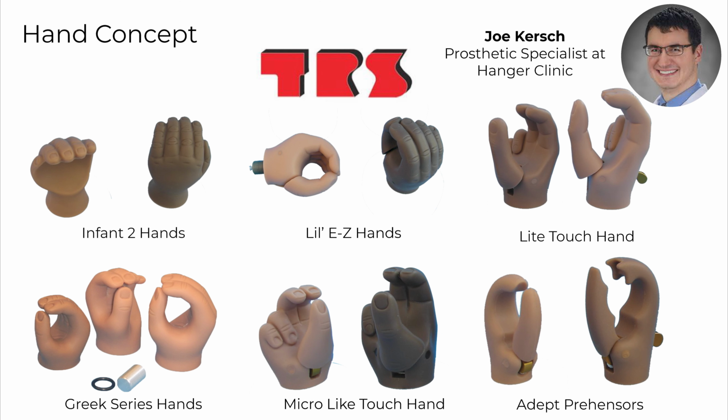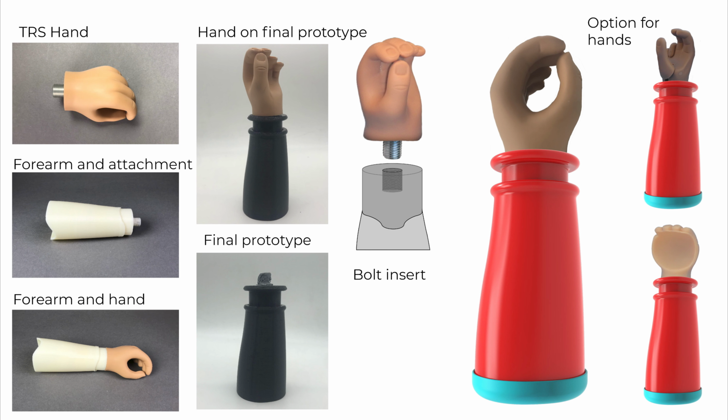TRS is a prosthetics company that provides a variety of different hands for infants with standard connections. We adapted the prosthetic to include the attachment bolt that TRS Prosthetics uses with their product. This allows for the hand to change out to more sophisticated hands as the child grows.